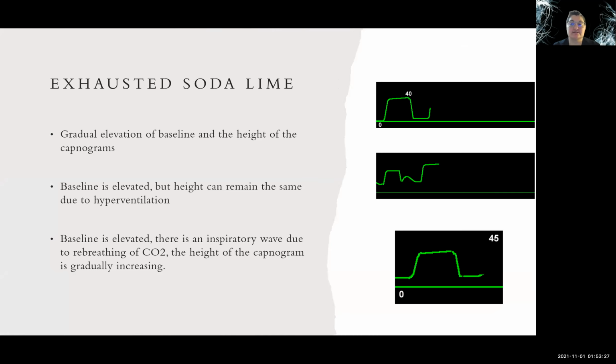Now, when we have exhausted soda lime or an exhausted CO2 absorber, we're going to have some changes as well. Frequency and rhythm are pretty much going to be regular, but it's our height and baseline that are going to be adjusted. The height is going to gradually elevate. It's going to go from normal and then gradually go up. But in some cases, it can remain the same due to hyperventilation.